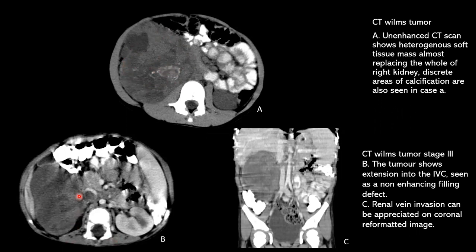This is another case of Wilms tumor, Stage 3, which shows involvement of the IVC as a non-enhancing filling defect and invasion of the renal vein.